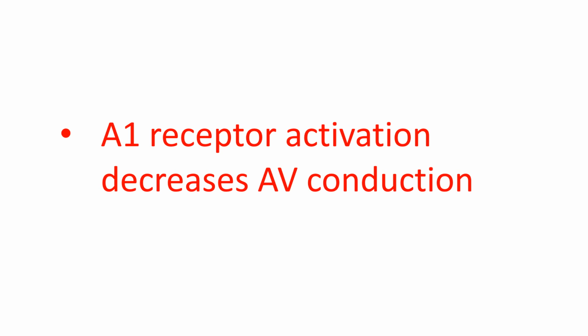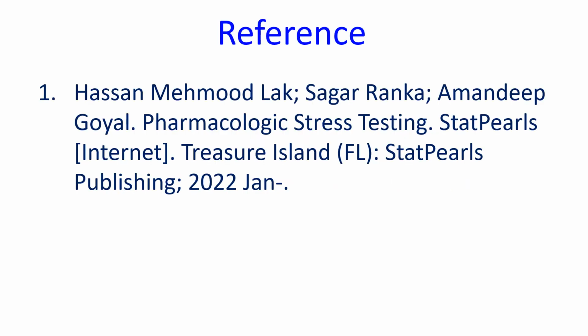Cardiac patients will be asked not to take nitrates on the day of the test. All these are followed strictly as per the advice of the individual treating physician, as the exact medical condition may mandate some modifications. Here is a useful reference.